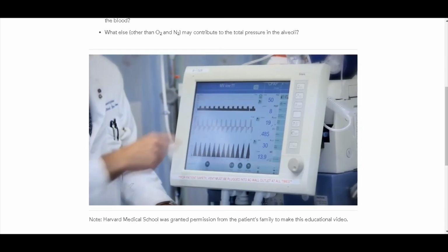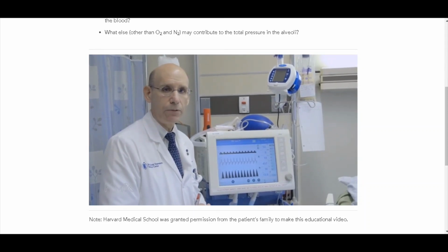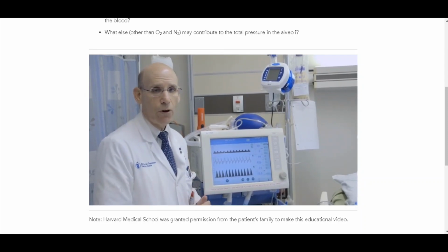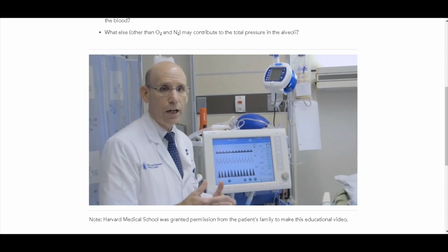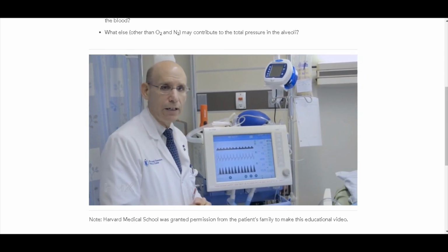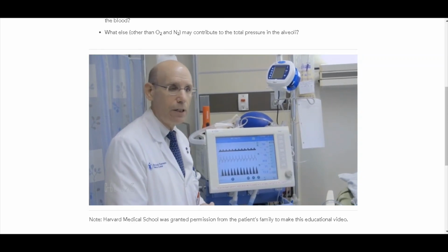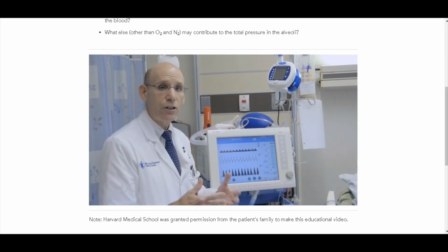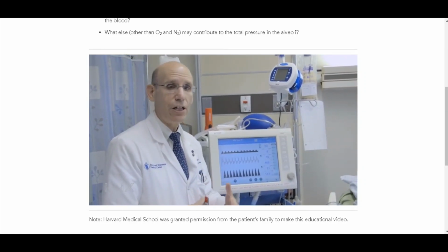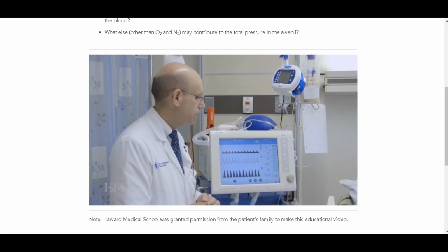This first number up here, 50, tells us the percentage of oxygen in the gas that's being pumped into his lung. So he's receiving 50% oxygen. We've talked before about how all of us breathing room air get about 21%. So already he's getting more than twice as much oxygen in the gas that's being pumped into his lungs. And this is to make up for problems at the level of what we call the gas exchange, the level of the air sacs or alveoli in the lung and the capillaries.